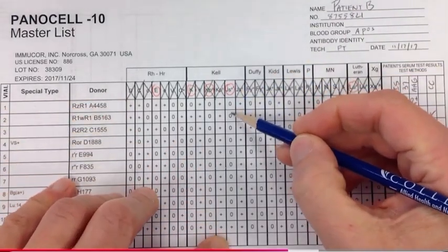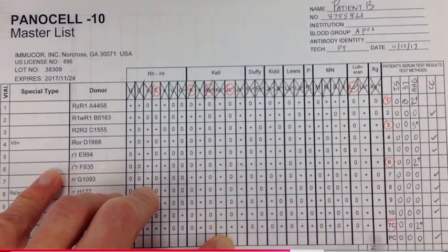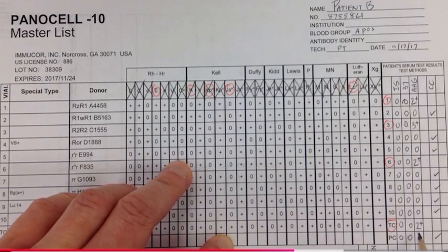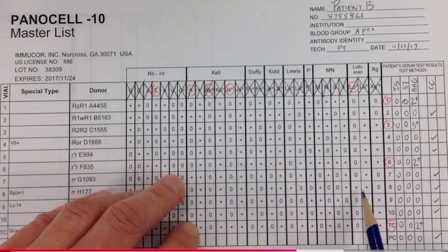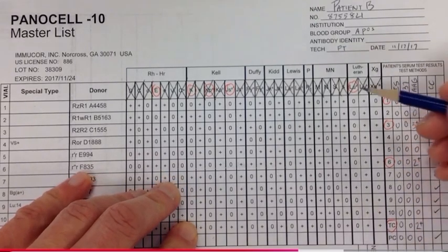Okay, JSA. All right, so this also is low incident, but we have a problem here because it's positive in one of the cells that's positive, and therefore we can't rule it out just yet. Okay, so let's see, Lutheran A. All right, so Lutheran A, also again low incident antigen.